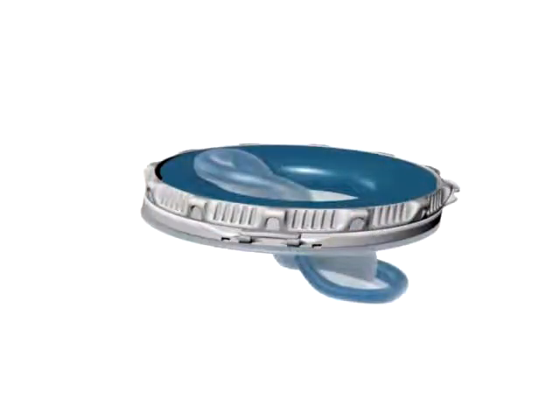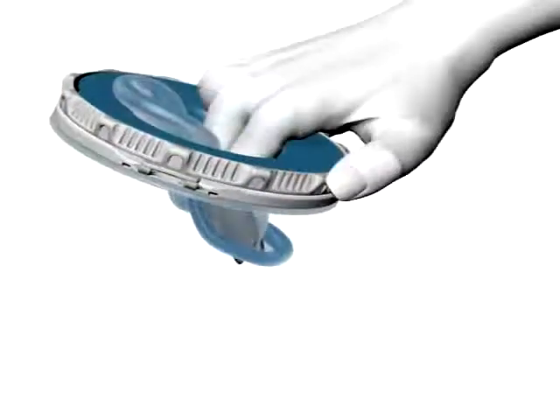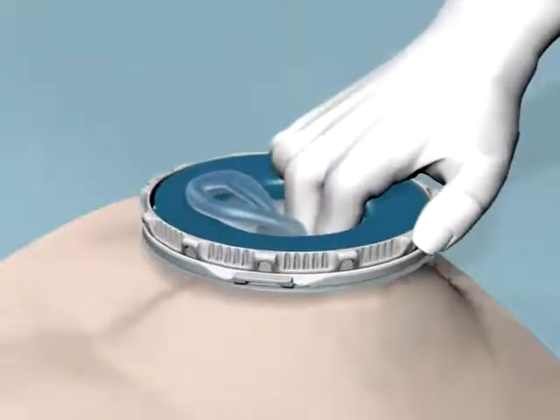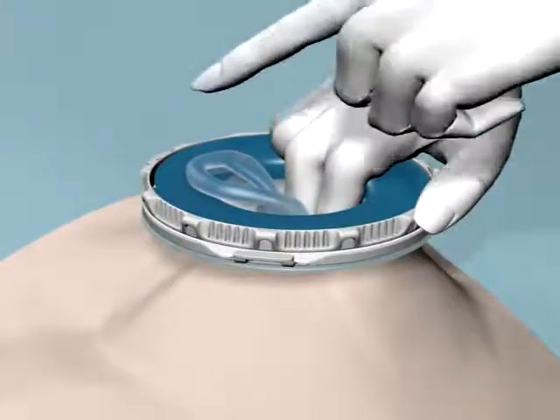If you are more comfortable with the one-piece design, the seal cap assembly and access retractor are designed to be installed as a one-piece unit as well.